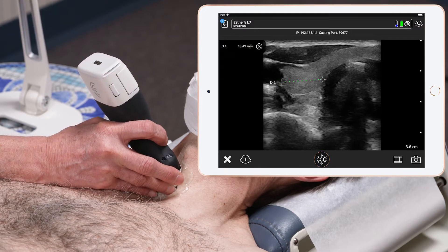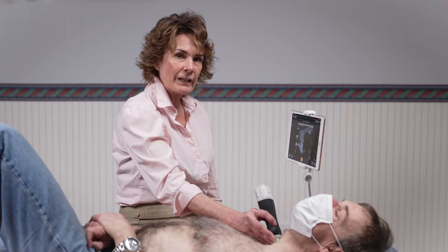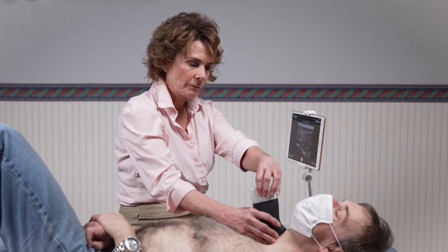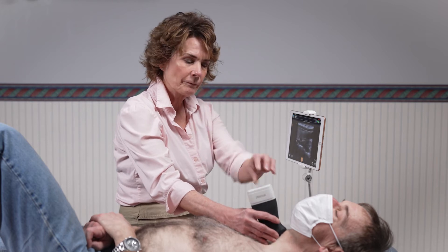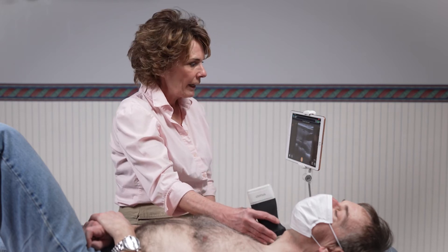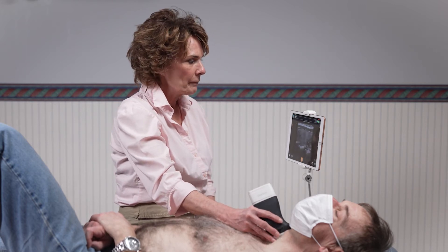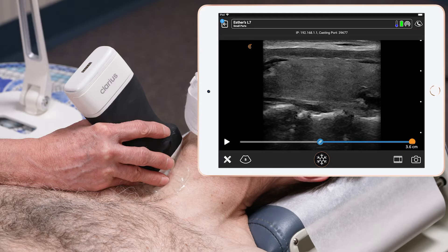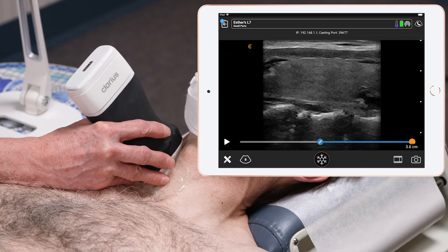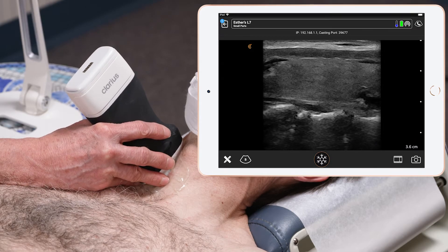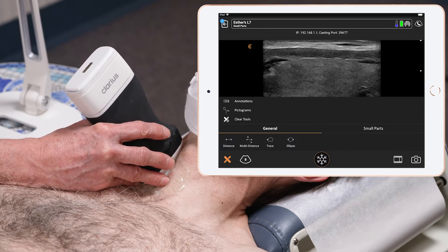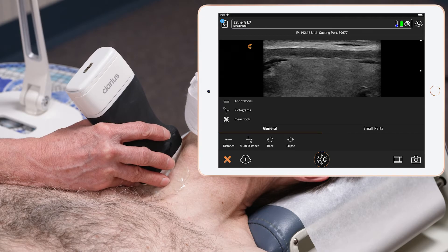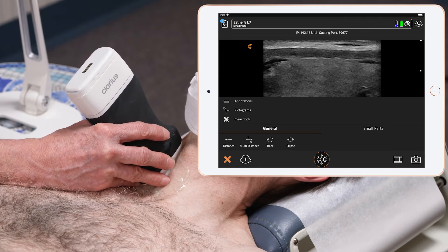I then turn my scanner to a sagittal plane, find the mid portion of the thyroid, go to the measurement tools on the lower left-hand side of the screen, and do the length and the AP measurements.